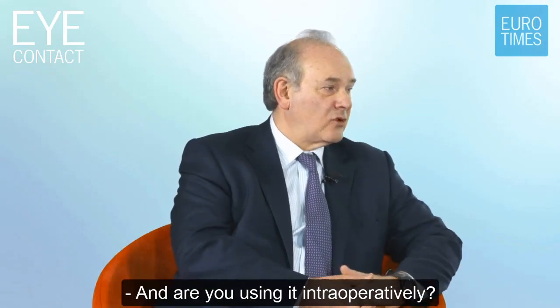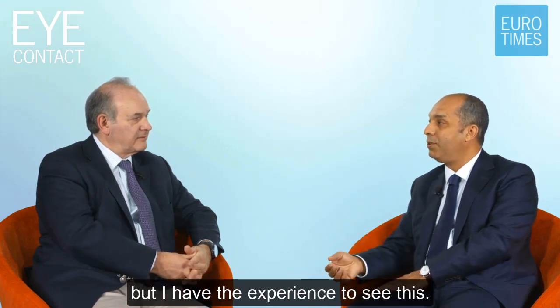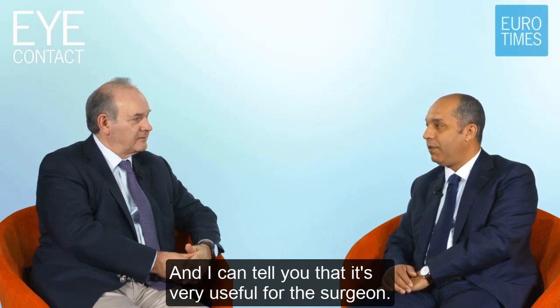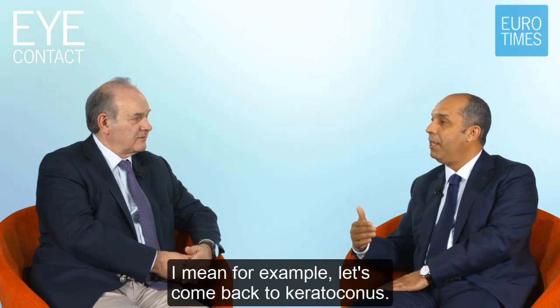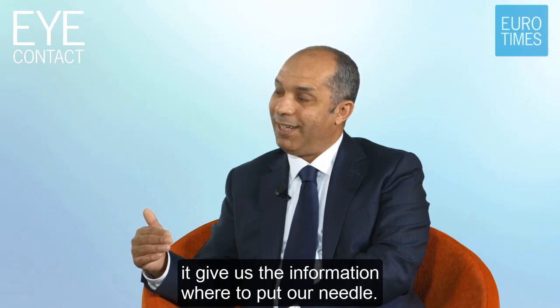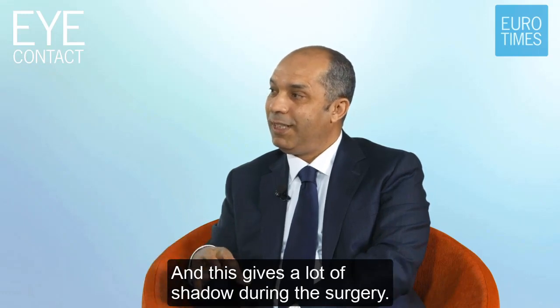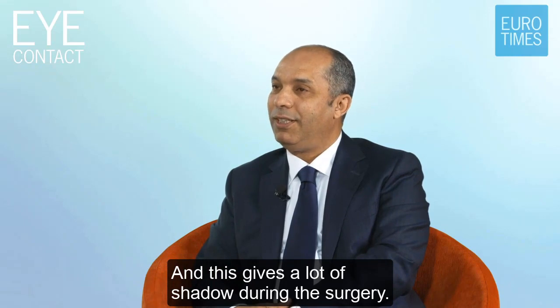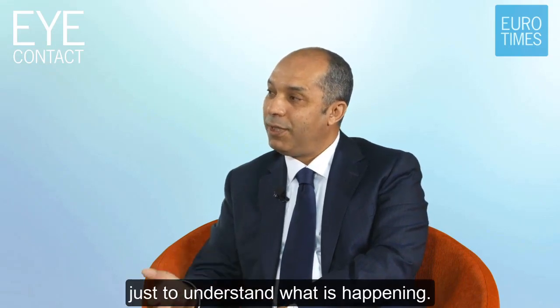And are you using it intraoperatively? I don't use it routinely intraoperatively, but I have the experience to see this, and I can tell you that it's very useful for the surgeon. It gives us a lot of information on all kinds of corneal surgery. I mean, for example, let's come back to keratoconus, for deep anterior lamellar surgery. It gives us the information on where to put our needle, but we should know that all the instruments now are metal, and this gives a lot of shadow during surgery. So we have to take all the instruments out of the area of surgery from time to time during surgery, just to understand what is happening.